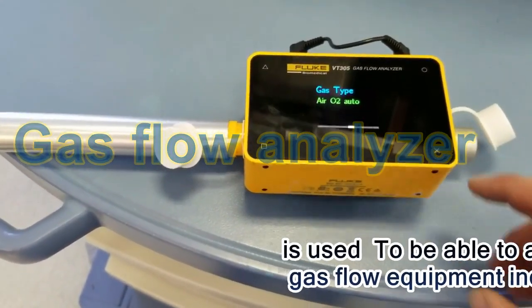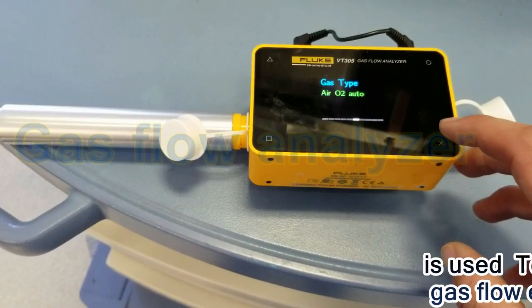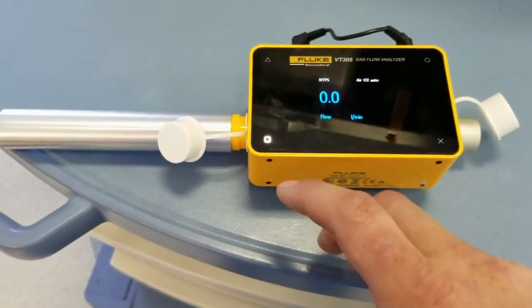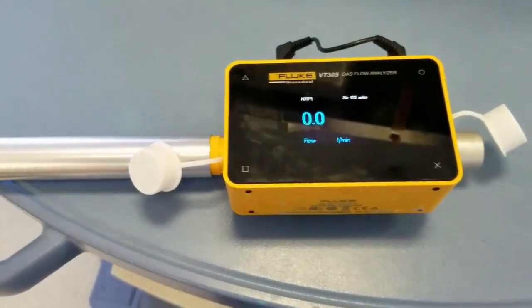On the gas type, I'm going to use the air and O2 mix, because we'll be using both of those in this test. Then we'll just hit the square button and bring up the flow in liters per minute.